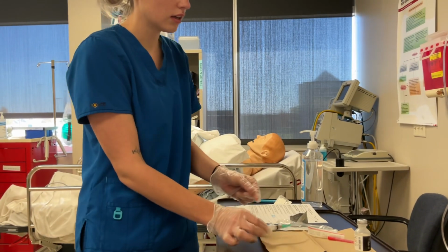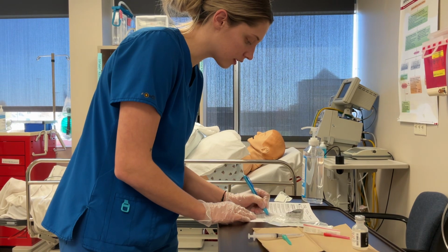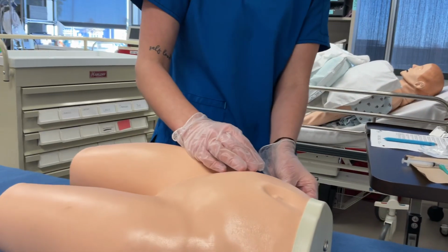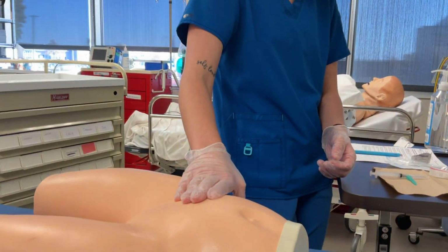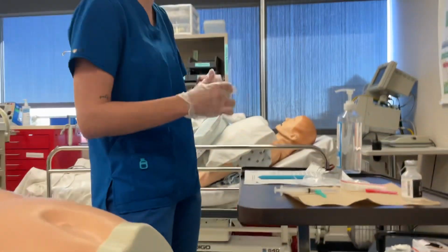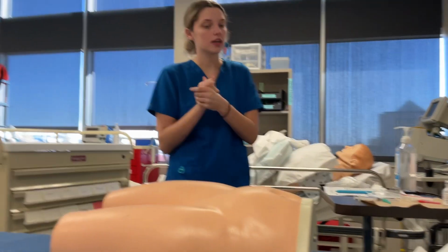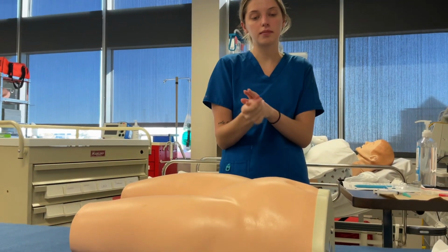Okay. And then I will document on my MAR my initials, the date and the time it was given. Okay. I will apply 2x2 gauze for pressure. I would assess if a Band-Aid is needed. I will take my gloves off. I documented on my MAR, I would document any norms per agency policy. I would reassess in 10 to 30 minutes.